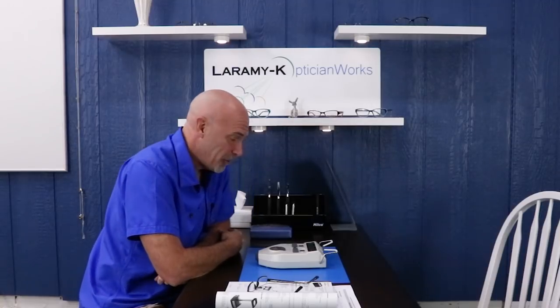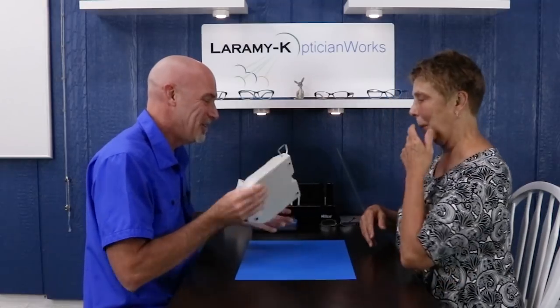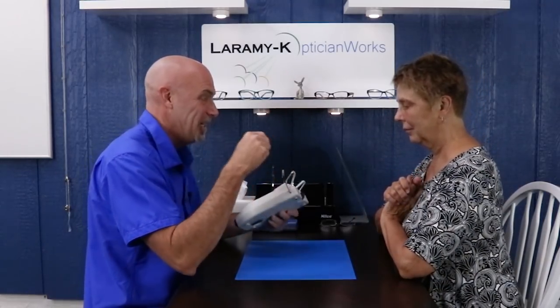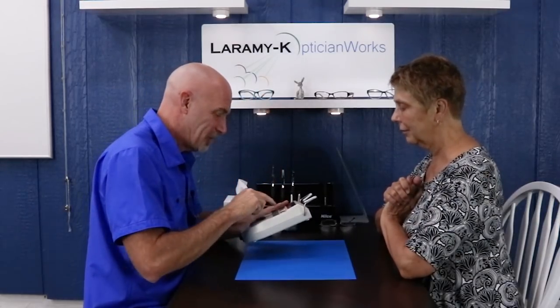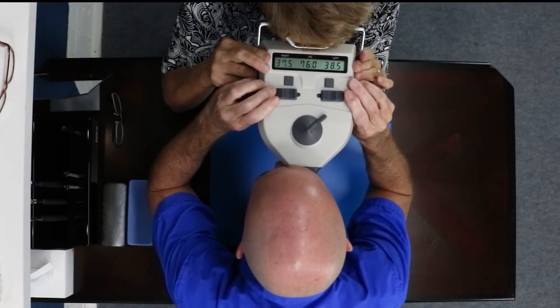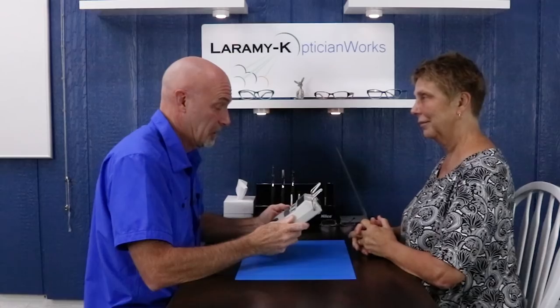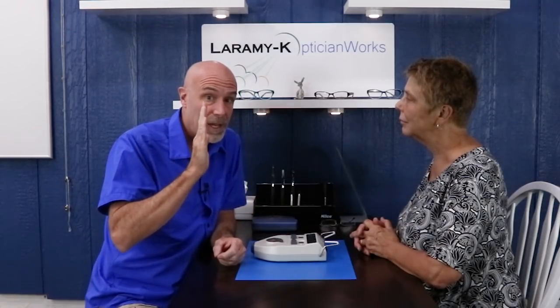I'm gonna go grab my assistant, have her come out, and let me take a look through my side of things. I am going to take your pupillary distance. I'm gonna rest this against your forehead and sit this on your nose. Inside here there's a target — it's white and then there's a green dot. I just need you to stare at the green dot for me, and you may hold this like a pair of binoculars. Looking inside there, it's really clear what I see. The light shines into her eye, it comes back through the visual, and you see a little sparkle of light that you block with the wires you're moving. The wires are really nice and big, you can block that light really easily. Reading is good and the light coming back is nice and bright — LED doesn't get much better than that.